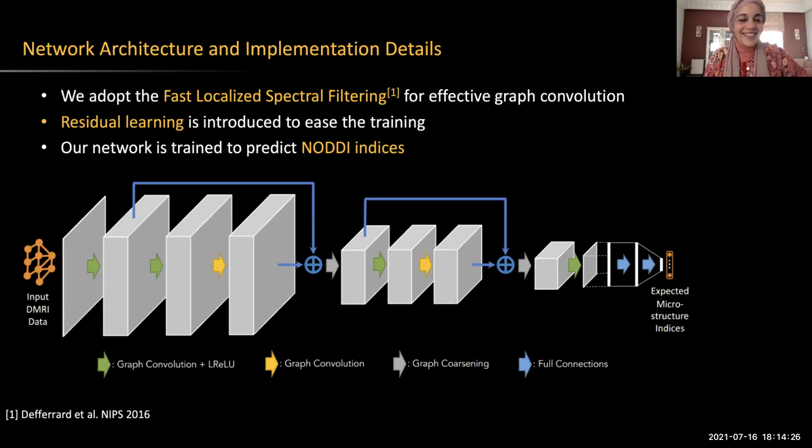Yeah, thank you. So here you went for GCNN, but you can also combine both, because diffusion is originally an image, but then you represent it as a graph to capture the relationship between different parts of the image. Still, you can use the typical image-based convolution and combine it with a graph-based convolution. Then this hybrid model will explore both representations of the data and characteristics. Awesome.